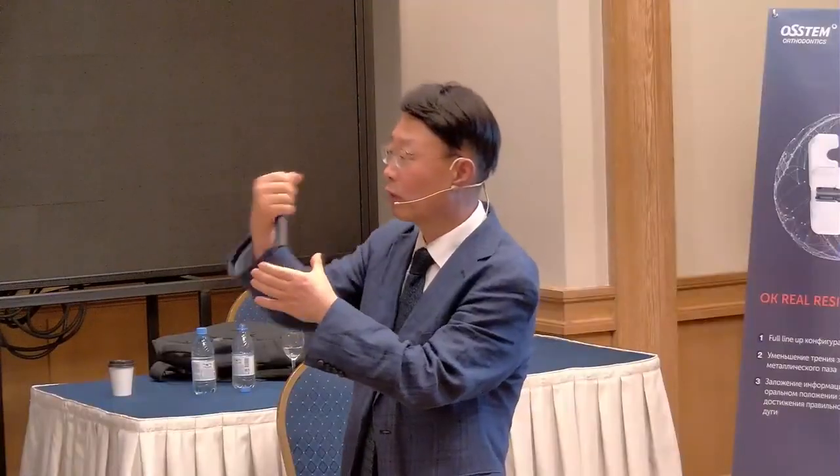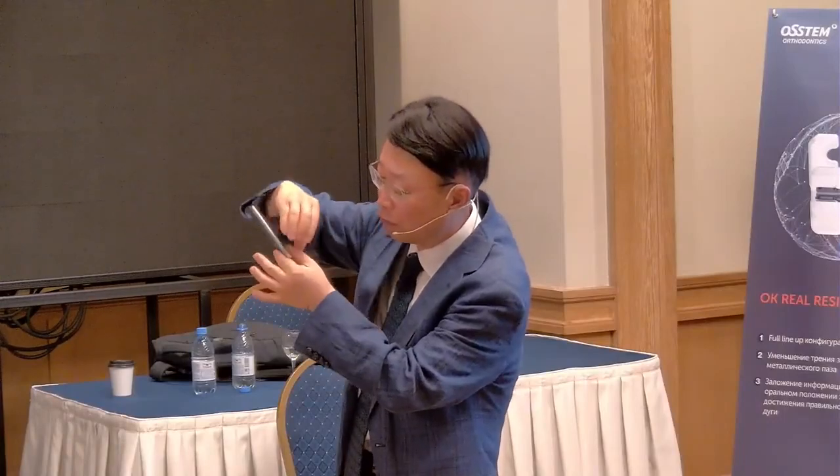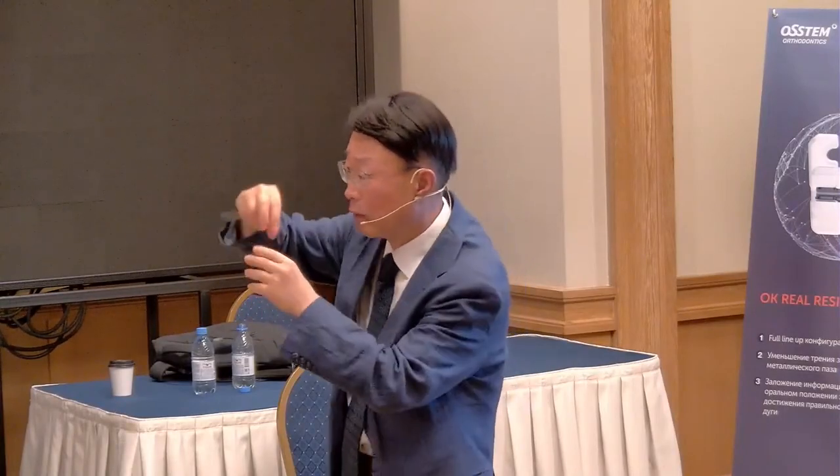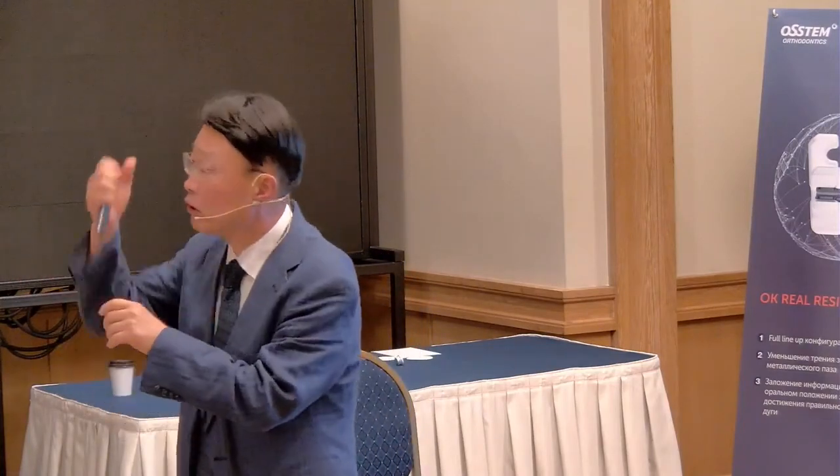You don't do the action like this one. Or with the forceps, if you push the forceps into the fossa, then maybe the bicuspid is very easy to extract. But when you do that, it can damage the cortical bone. So just grab the head, the crown, and a little relaxation, and minimize the cortical damage.